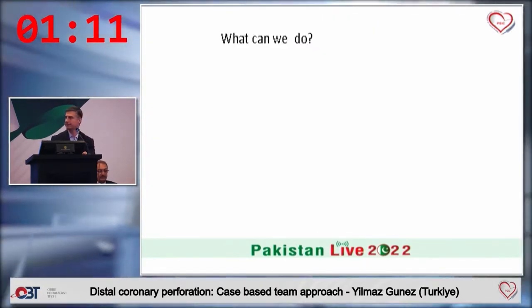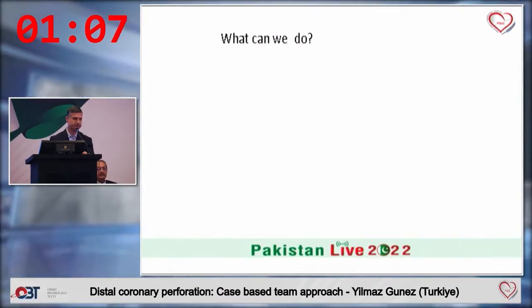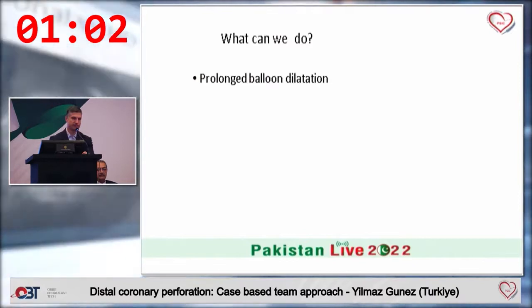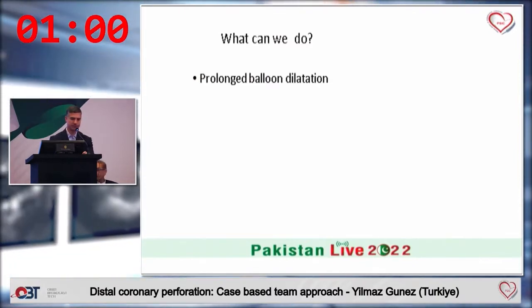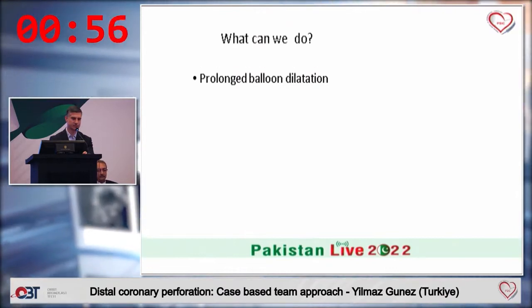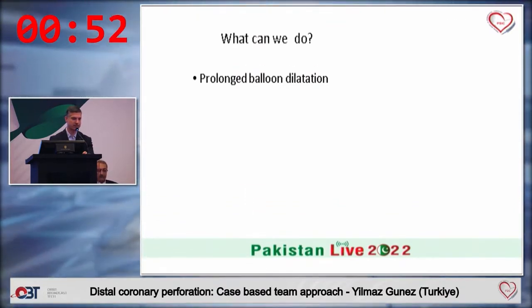Next slide, please. So what can we do now? We have tried prolonged balloon dilatation before, but again, now our first approach will be prolonged balloon dilatation again.